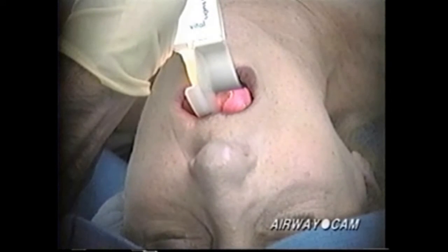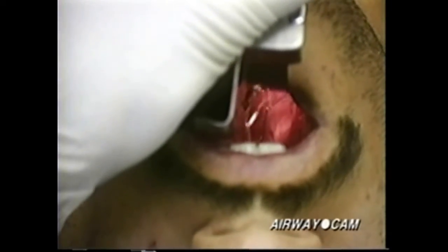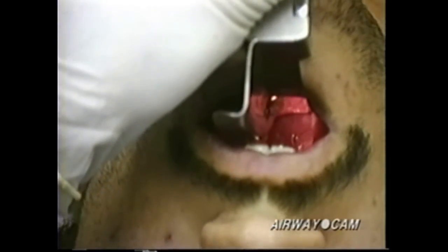If neither the epiglottis nor the posterior cartilages are visualized after blade insertion, the pink mucosa represents either the posterior pharynx, in which case the blade needs to be inserted further, or the esophagus, in which case the blade needs to be withdrawn. Entrance into the esophagus following blade insertion is very common with a large Macintosh No. 4 blade or the longer straight blades. Remember, the epiglottis is attached at the base of the tongue. If you are having trouble finding a landmark, methodically advance the blade down the tongue until it comes into view.